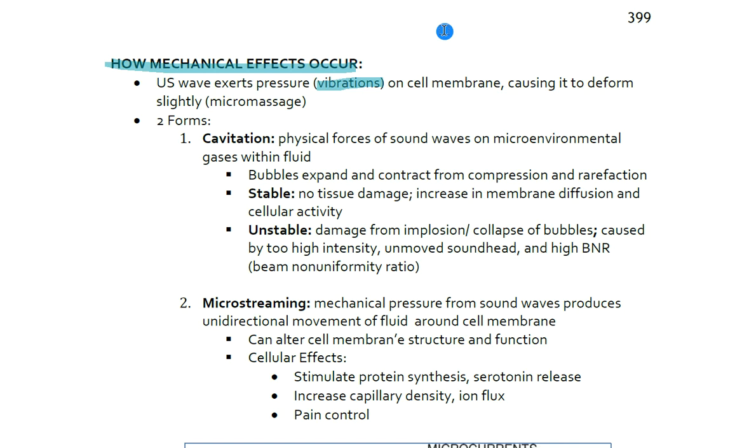With therapeutic ultrasound, instead of waiting for those waves to bounce back, we don't necessarily get readings of them coming back. You will with real-time and Doppler ultrasounds and other types of ultrasounds. But with therapeutic ultrasound, we're trying to emit those waveforms into the tissue so that they cause these vibrations and cause this micromassage, these natural acoustic-initiated deformations of the tissue.